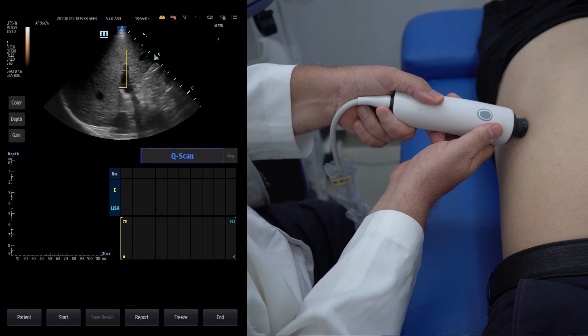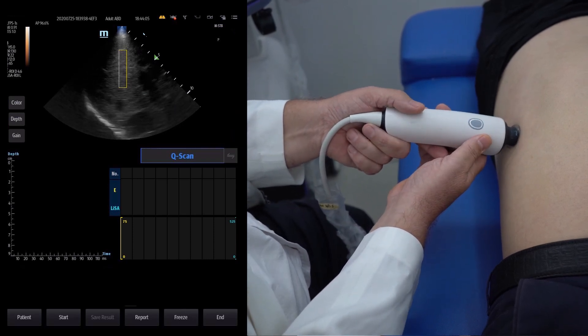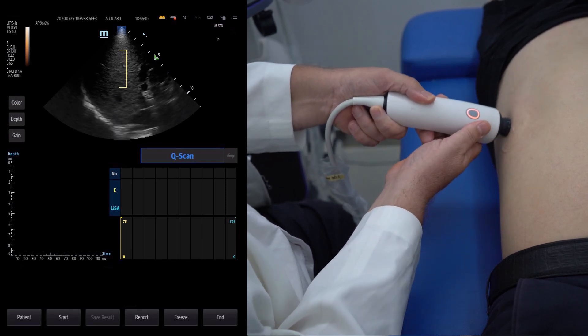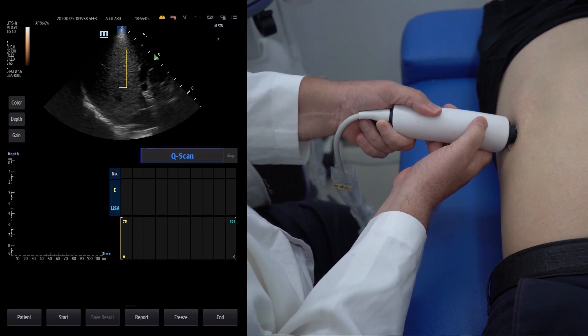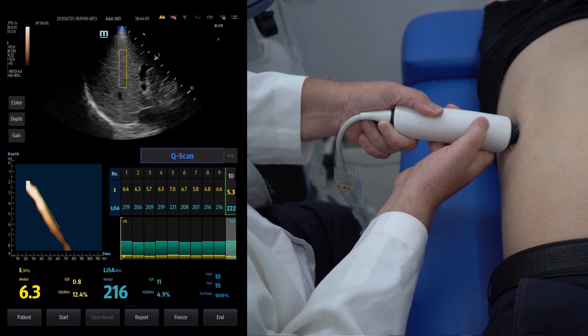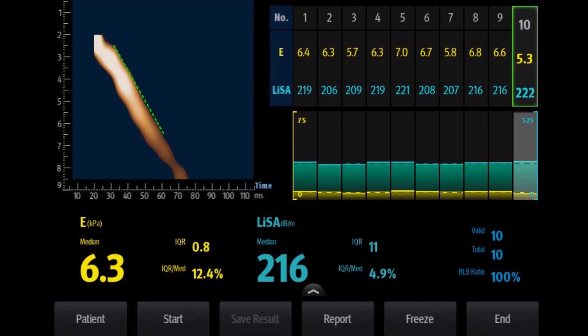To trigger the measurement, get a good B-mode image, apply pressure on the probe, and if necessary, ask the patient to hold their breath. When you're ready, press the button on the probe, or click the start button on the screen. Please remember to hold the probe steady during this process — it's very important. Every measurement will give you a group of 10 valid results. The median E-value and the LISA value will both be displayed on the bottom of the screen. The E-value represents liver stiffness, and the LISA value represents the steatosis level of the liver. Make sure the IQR divided by median of E-value is less than 30%, and the IQR for the LISA value is less than 40.